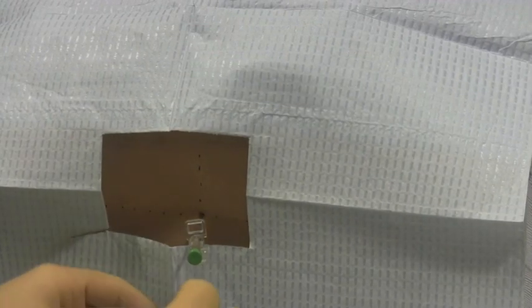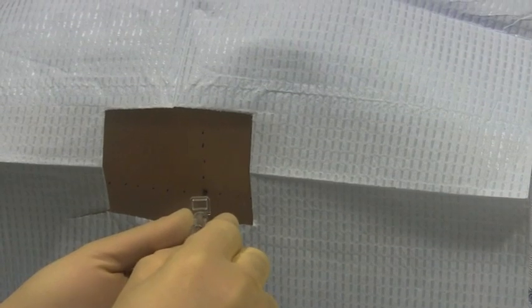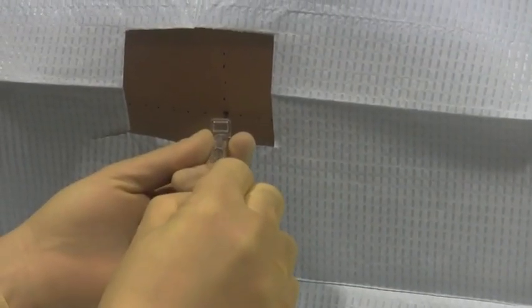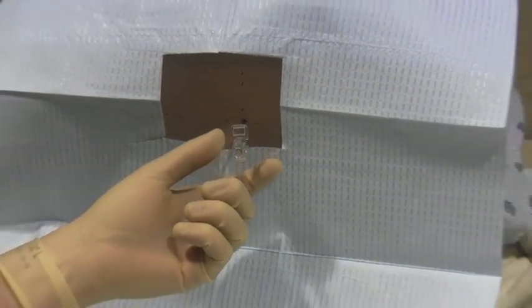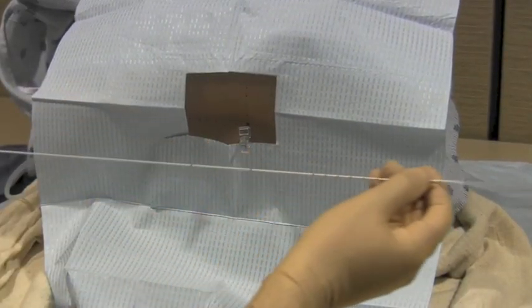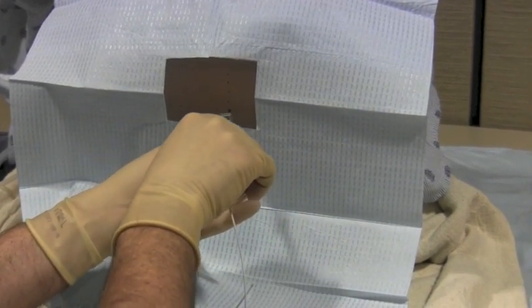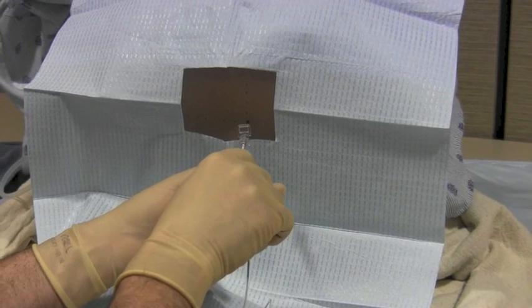The bevel is turned up towards the head, and the stylet is removed. Once the stylet is removed, if we're in the thecal sac, CSF will egress from the needle. The tubing is now gently inserted through the needle into the thecal sac.